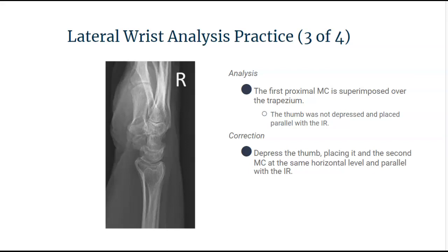Looking at this lateral wrist projection, we can tell that a lot of the elements meet evaluation criteria. This wrist looks like it's in a true lateral projection — the articulation is demonstrated superimposed, the carpals are superimposed, and the scaphoid and pisiform are in alignment. However, when you look at the trapezium, there is an issue. The thumb is superimposing over the trapezium and it should be in profile. This lets me know that the thumb was not depressed and placed parallel with the IR. In order to correct this positioning, depress the thumb and repeat the image because the trapezium should be demonstrated in profile.